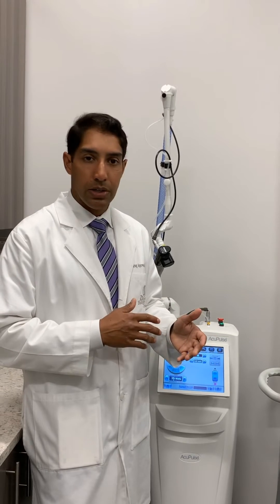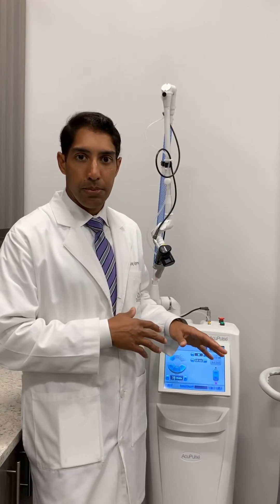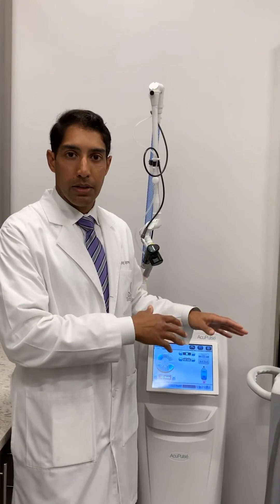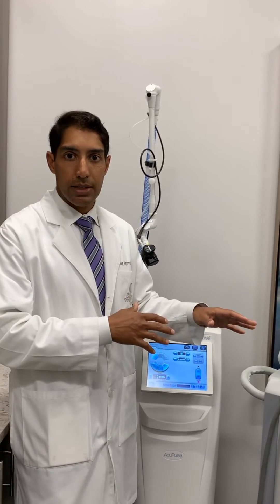I'll go ahead and show you the differences. They each have different downtimes — the most being the fully ablative CO2, the middle being the fractional CO2, and then the least being the Erbium — but they also accomplish different things.